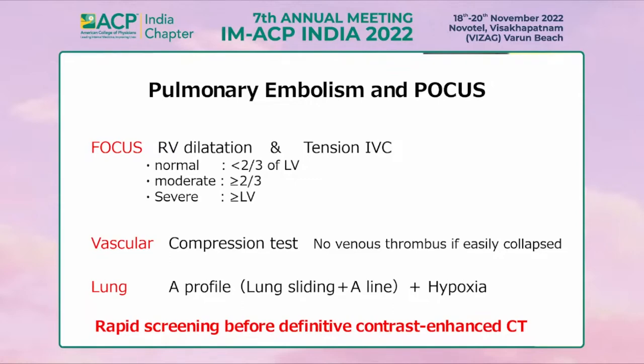Normal pattern of lung ultrasound. A profile of the BLUE protocol and hypoxia is one of the characteristics of pulmonary embolism. POCUS allows rapid screening before contrast-enhanced CT scan.